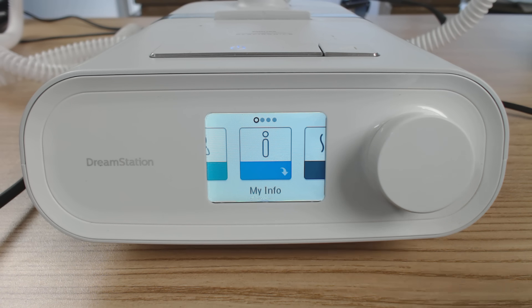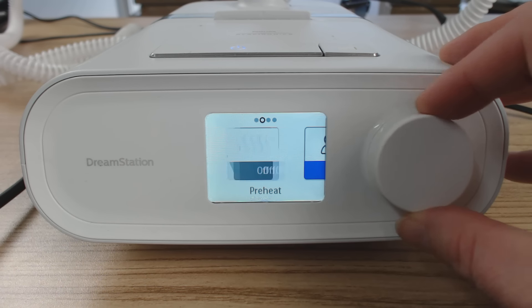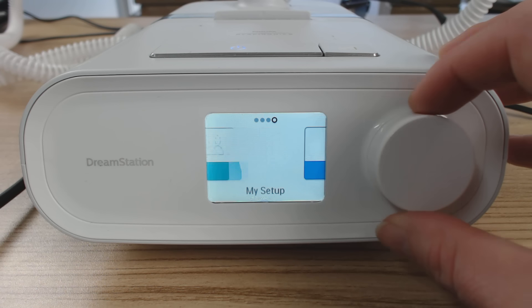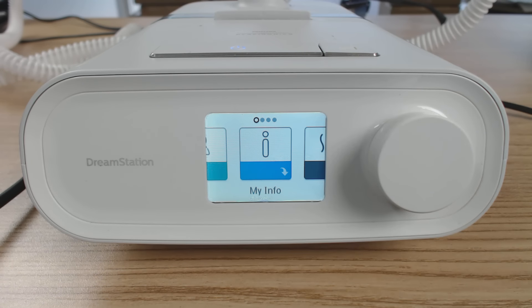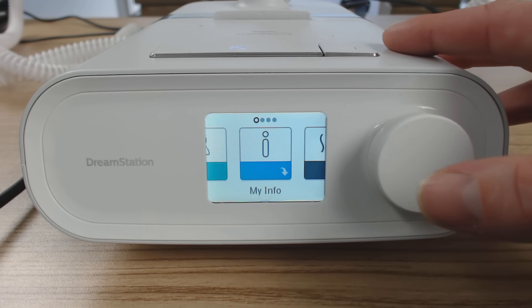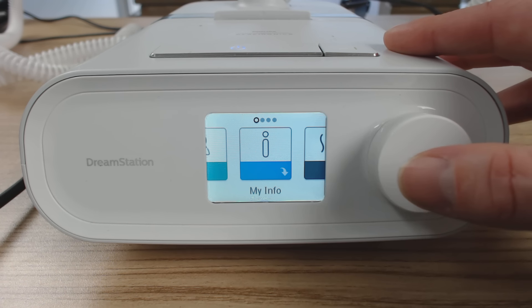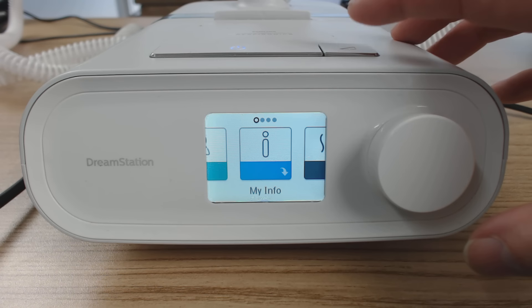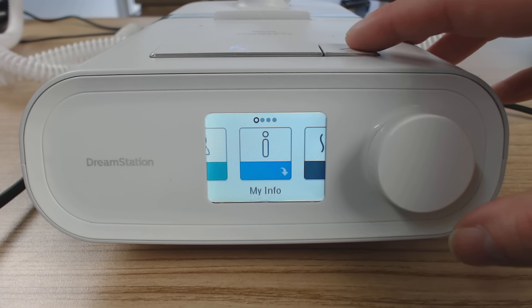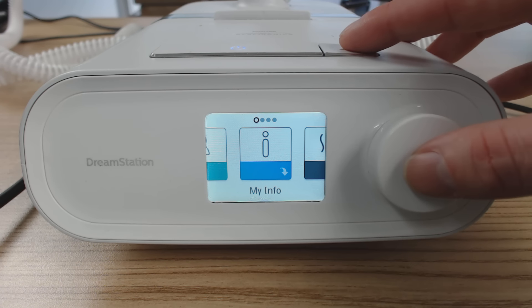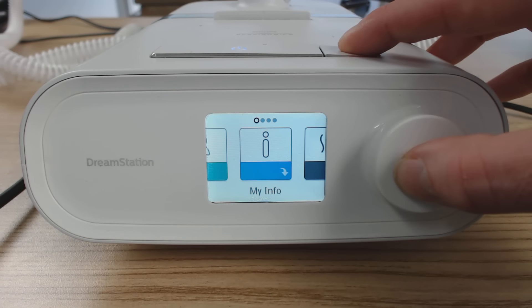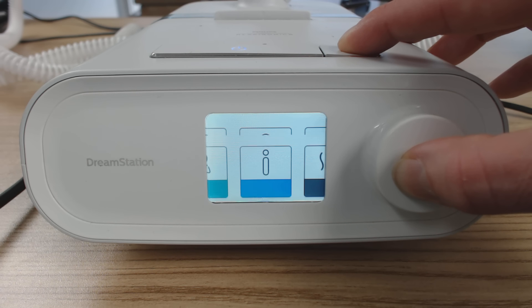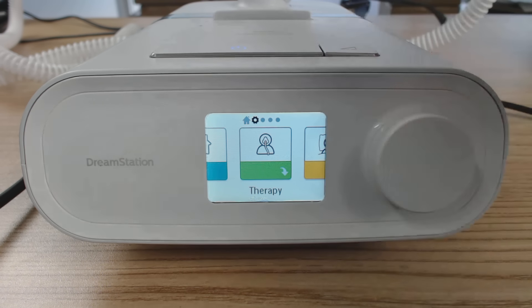So without further ado, this is normally our patient menu on the front here. What we're going to do to get into the clinical menu is hold down the click dial — push that in — and then simultaneously push in the ramp button with the triangle on it at the top. Push these two buttons in, hold simultaneously, keep holding them down, and then you'll see the menu drop. There it goes.